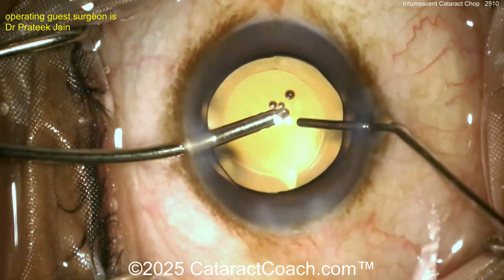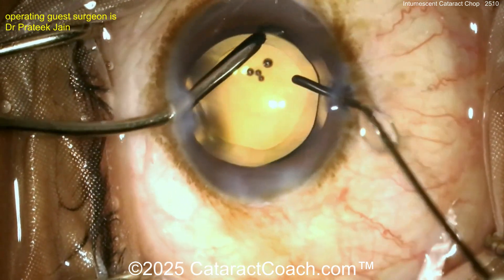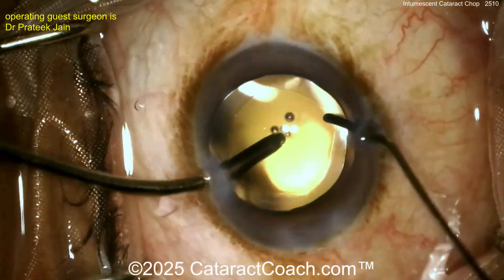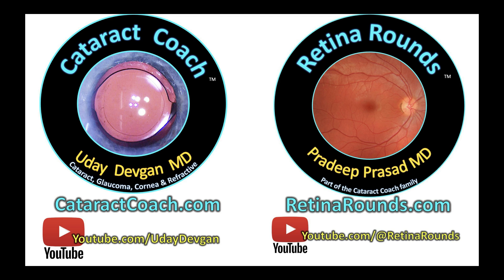Finishing up the case — that looks good. A beautiful looking rhexis, about a 5mm rhexis with a 6mm optic, very nicely done. The rest of the case is routine. Check out CataractCoach.com our teaching website, and of course check out RetinRounds.com — I promise you're going to learn so much, you're going to love it.